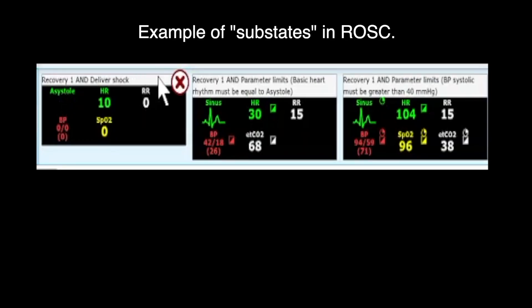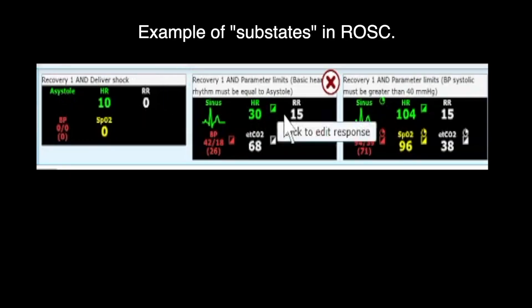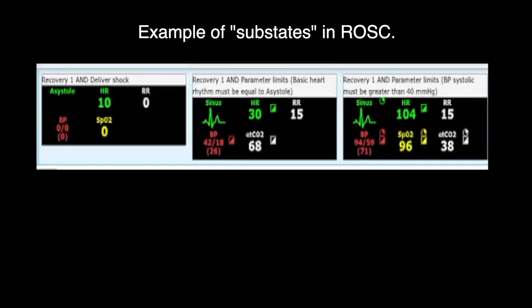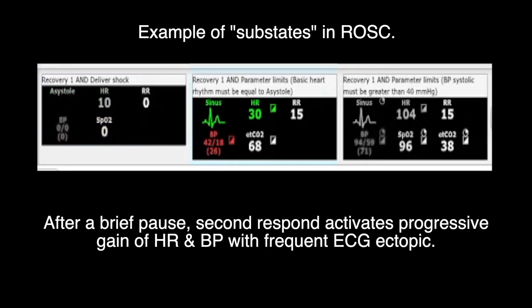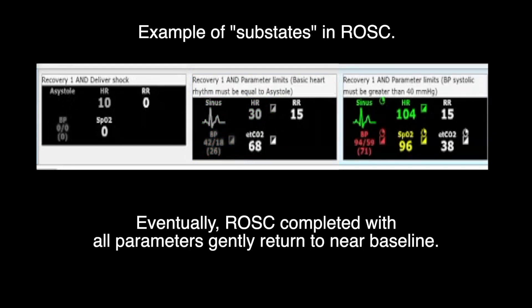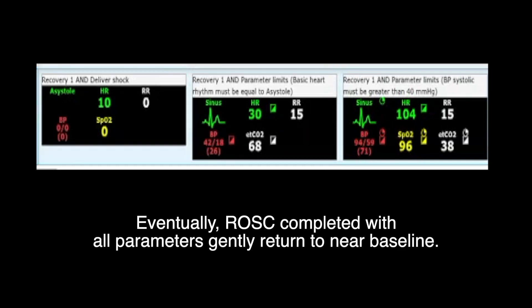Additional examples of scenario events with multiple response or substates. Return of spontaneous circulation event flow is packed with three responses. Initially, the detected defibrillation turns shockable rhythm into a flat line. After a brief pause, second response activates progressive gains of heart rate and blood pressure with frequent ECG ectopics. Eventually, ROSC completed with all parameters gently returned to near baseline.